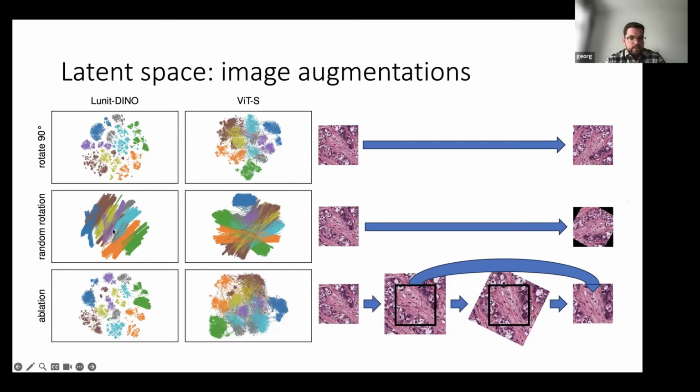visualization where there's a bunch of jumps everywhere, and we were at first quite confused by that. But then we had the hypothesis that this might be because when rotating by random angles, you obtain these black edges. And we actually found that that was the reason why we see these large jumps.